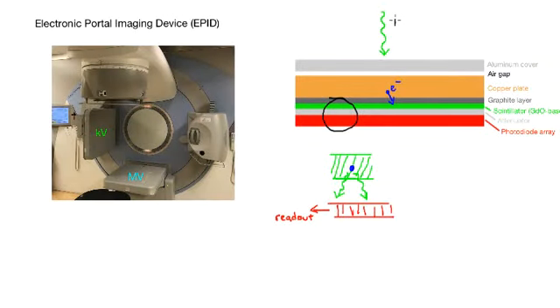So if we look back here for how X-ray images are generated, there are two important sources of that. One is the number of photons, n photons coming in per pixel, and that's going to impact the noise. Because this is a random counting process, you've got n photons on average coming into that pixel, but how many you observe is a random process. Let me describe the mathematics behind that.